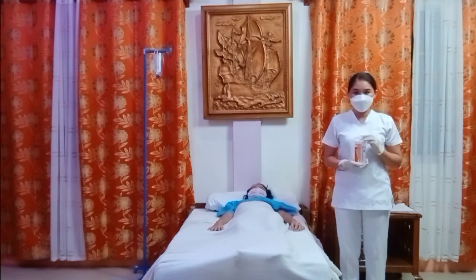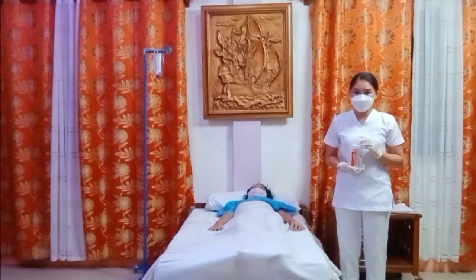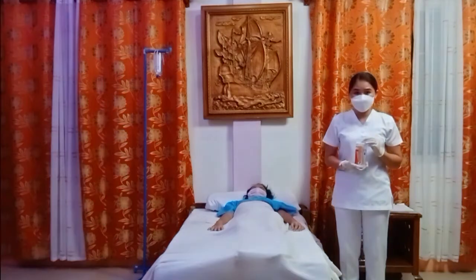And as for the axillary temperature reading, which I will be doing for this procedure, is to pat first the axilla dry if moist. This is because moisture can alter the temperature reading.